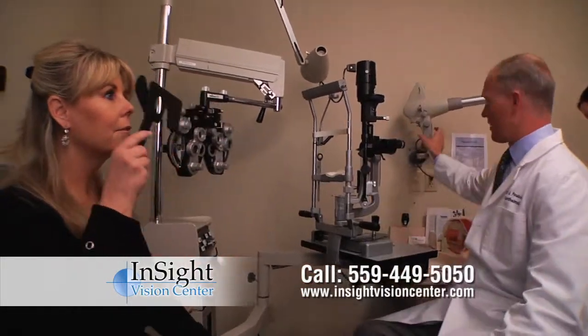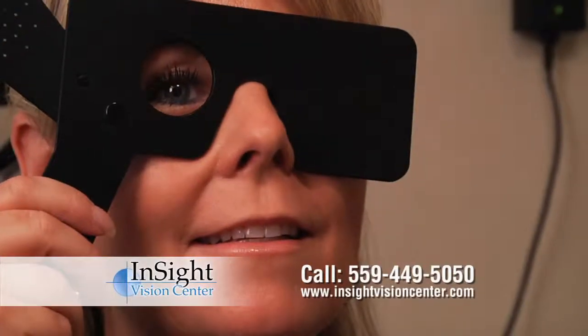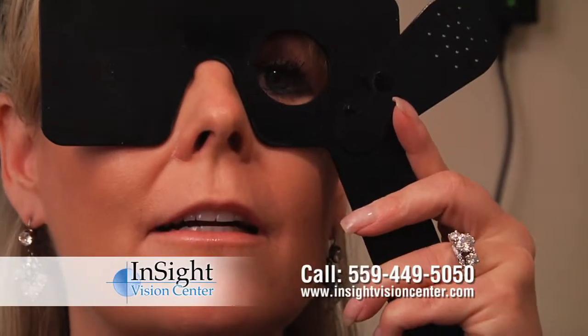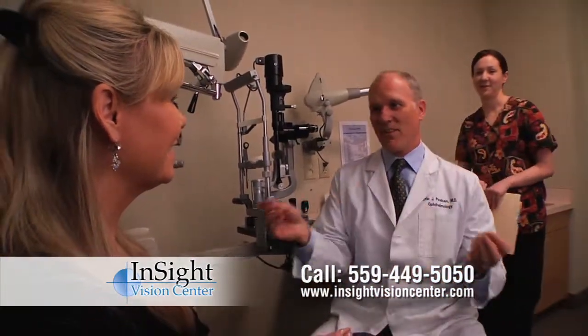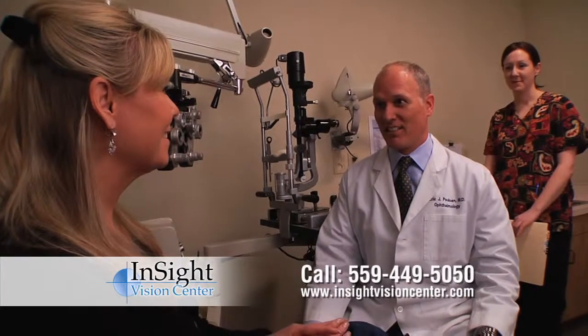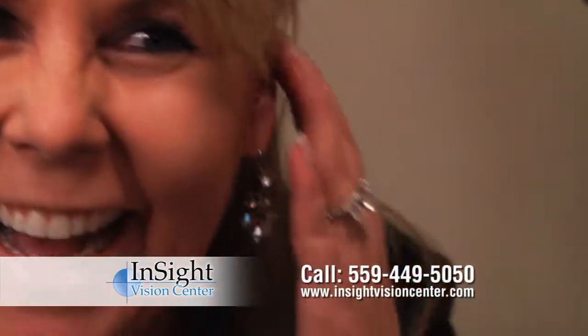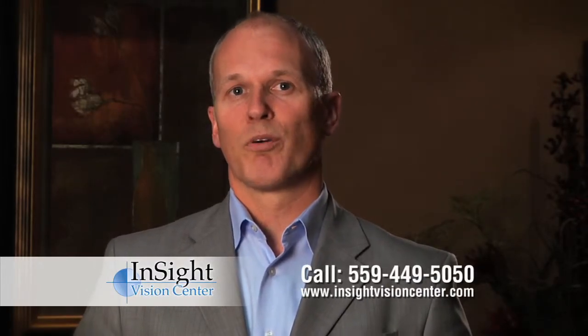The day following surgery, we'll check your eyes in the office, and most people notice a dramatic improvement in their vision. In fact, the majority of patients would see well enough to pass the DMV driving test the day after surgery. Our goal is always to help people see 20/20 or have normal vision with no corrective lenses. Sometimes your vision may be even better than that. Following surgery, we'll provide you with antibiotic eye drops to prevent infection and to assure that the healing process goes smoothly. These eye drops are typically used for approximately 1 week.